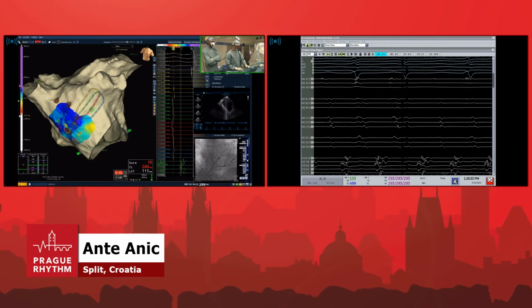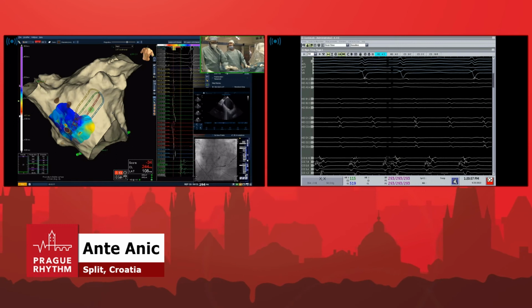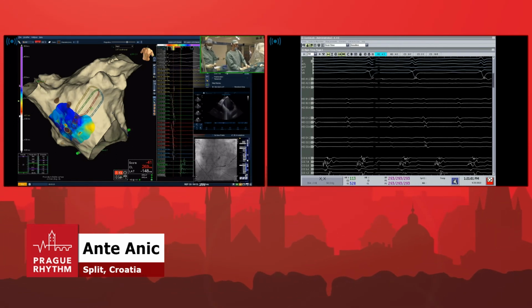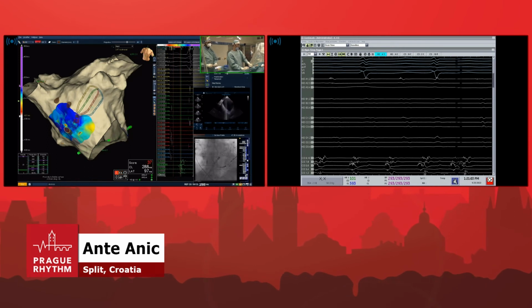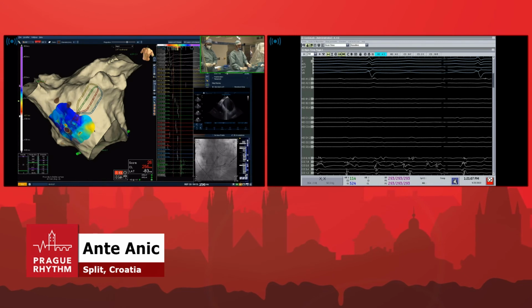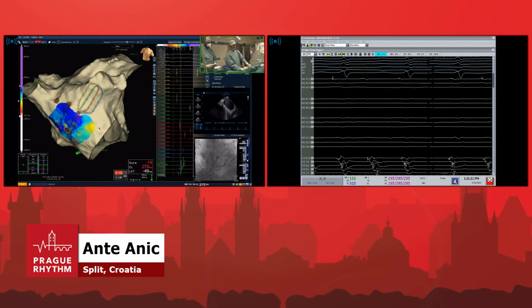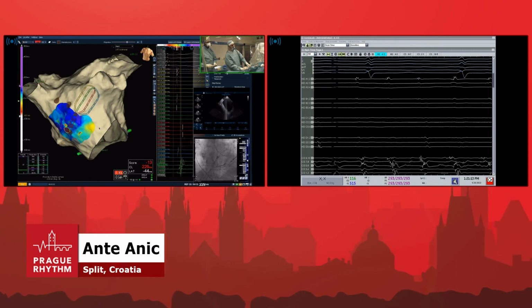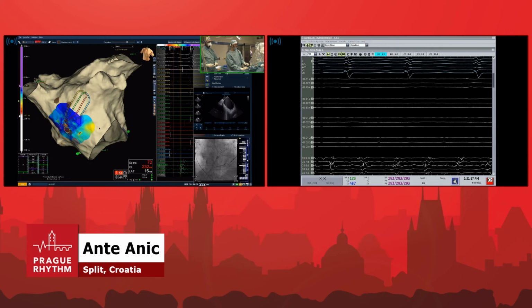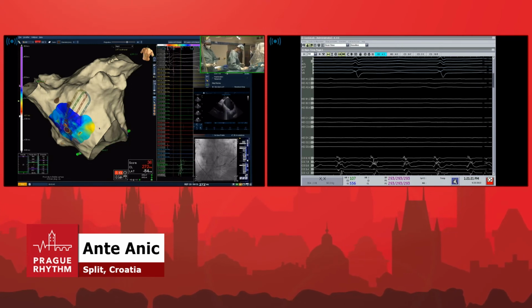Ante, I have a question. Wouldn't you be afraid of damaging the AV node if you would ablate with pulsed field in this lower septal area? Yeah, we would never ablate that. So we would gently, we would do it not to come close to the annular region. We would ablate here and likely stay close to the roof, septal part of the roof. So we have experience in 3 patients so far, and hopefully we could avoid it.